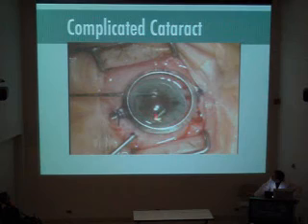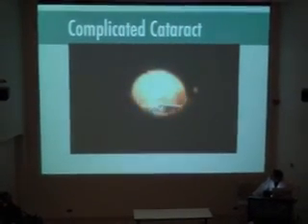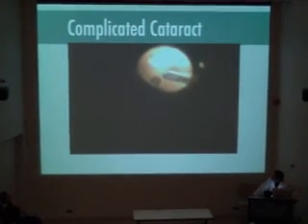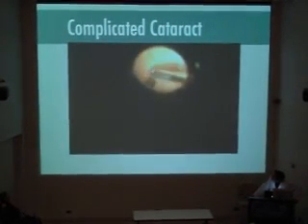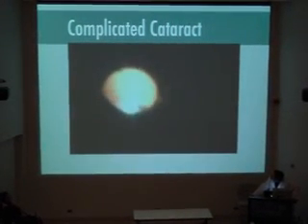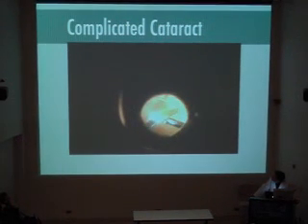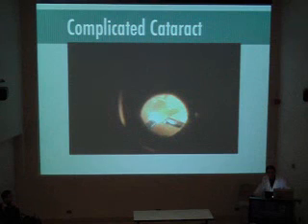You see these white sort of particles throughout, and in a minute when we turn the microscope on, you can see there's big chunks of cataract inside in the back. There's a big piece there that's being taken out, but it's floating around in the eye. It's interesting, the reason you can't just leave these pieces in someone's eye. If a cataract operation is done and these pieces fall in, the body interprets them as foreign materials, and this really dramatic inflammatory response happens.